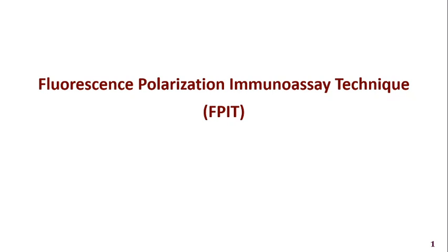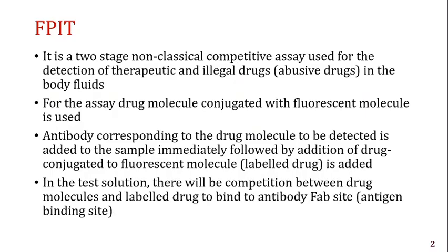This technique involves two different procedures or two different identification molecules or procedures. For example, it uses a fluorescent probe as well as it will use plane polarization of the light as an indicator for investigation of the target molecule.